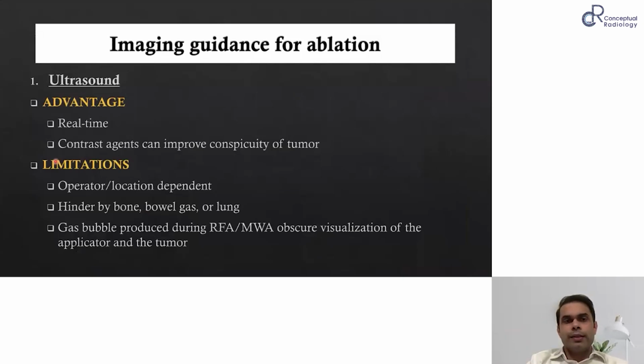Ultrasound, the advantage is real time. You can actually see the probe going in. You don't have to come out, do the repeat scan, keep going in, keep coming out. You can actually see, and then you can see the ablation happening. You can see some air bubbles forming, actually seen in real time.